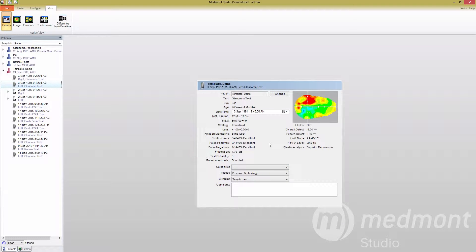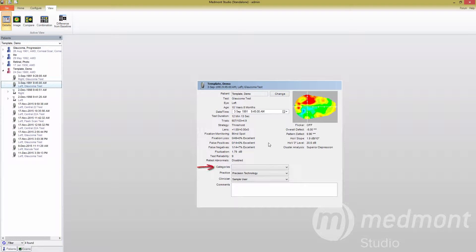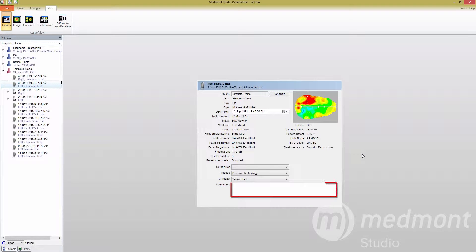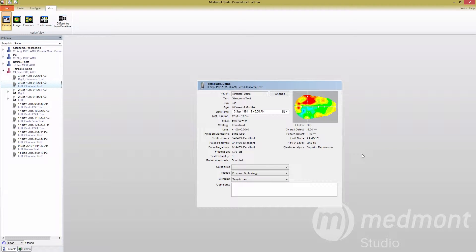You can also change the patient the test is assigned to, or update the date and time the test was taken. You can assign the test to a specific category, like baseline or pre-operation, and if you have the wrong practice or clinician selected when the test was taken, this is the place to update that information. Finally, you can add comments on the test. This is the window to go to if you're looking for a quick summary of the information found in the test.